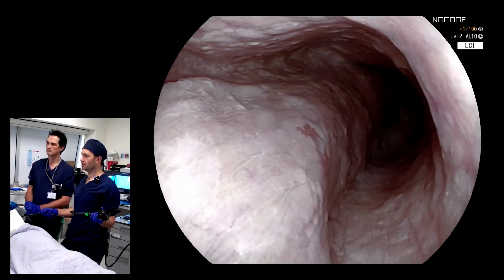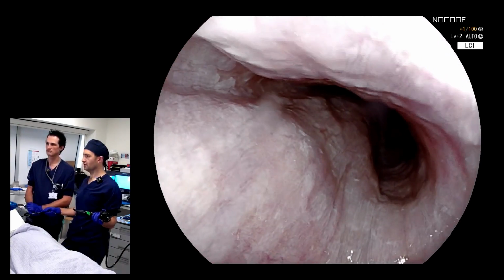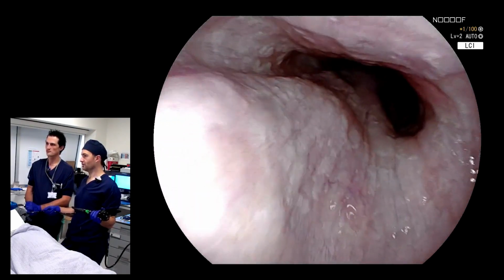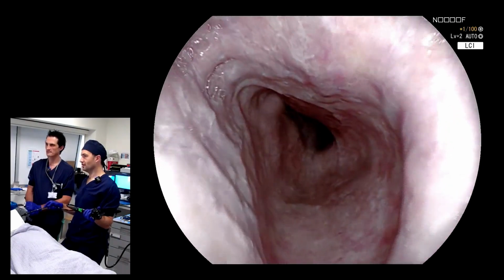And it's important to say, you can see the position of the spine here. You can see the vertebrae clearly in this esophagus. That's obviously marking the 6 o'clock position, if you need any kind of landmarking for your positionality.